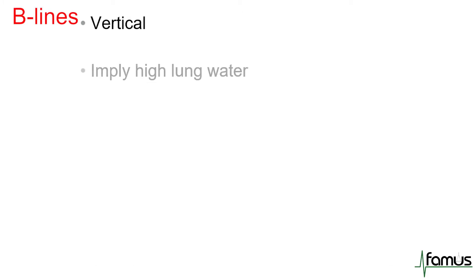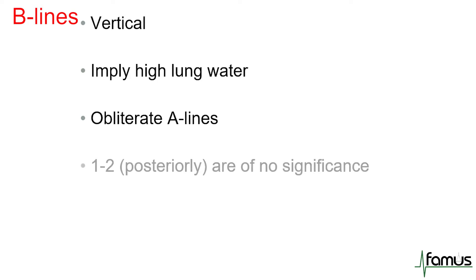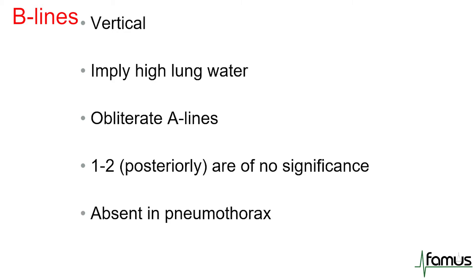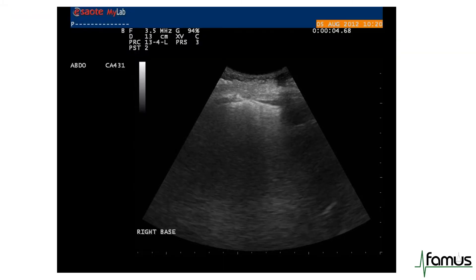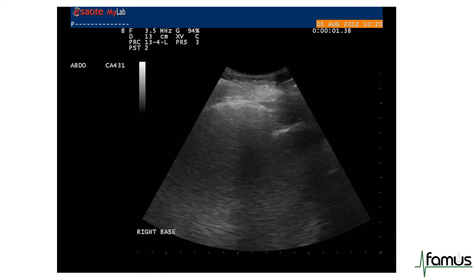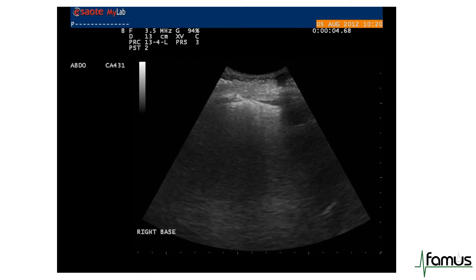B lines, by contrast, are vertical. They tend to imply high lung water or a wet lung. They obliterate A lines where they're present. Usually one to two posteriorly, towards the lung bases, are not considered significant. They are absent in pneumothorax — so if you see B lines, it effectively rules out pneumothorax. You will see B lines in conditions like ARDS, left ventricular failure, and in pneumonia, including COVID pneumonia. You can see multiple vertical B lines in this slide, which move with respiration, and you'll notice there's an absence of A lines.